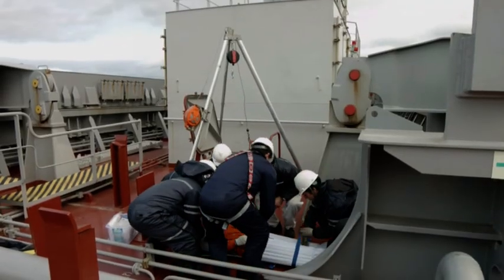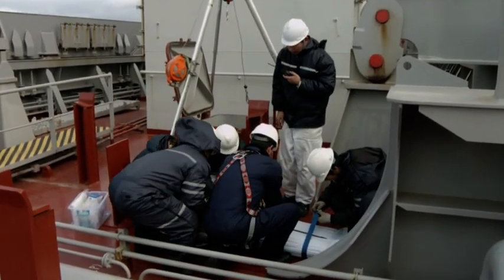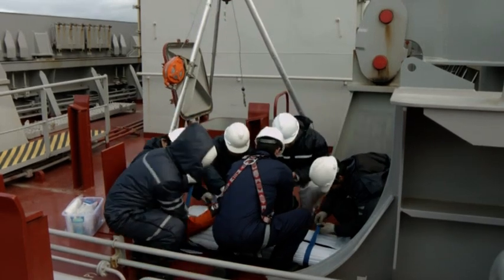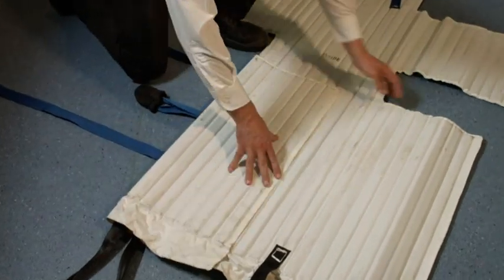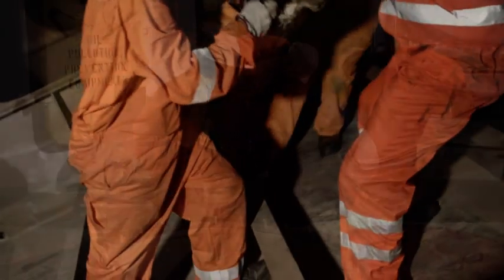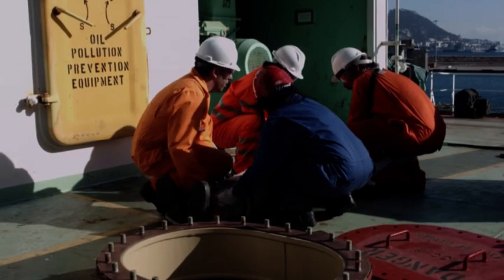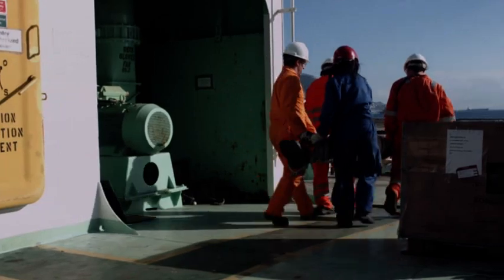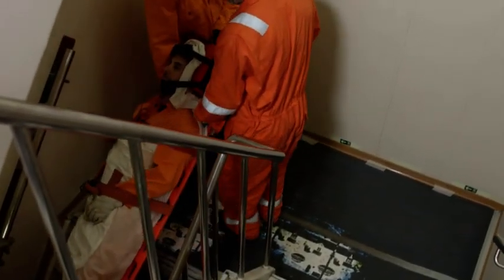If there's any vertical lifting to be done, the casualty's arms should be fastened down the outside, as there is a risk of the casualty falling out of the bottom when they are fastened on the inside. As this is a very flexible stretcher, it's ideal for enclosed space rescue. But this flexibility also makes it unsuitable for casualties with suspected spinal injuries, as it offers very little support and bends in the middle.